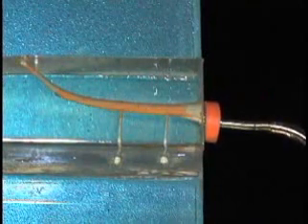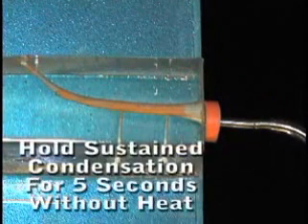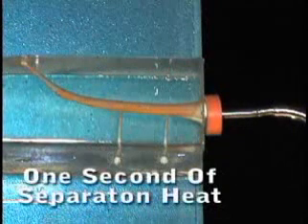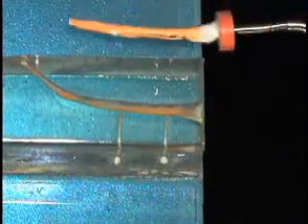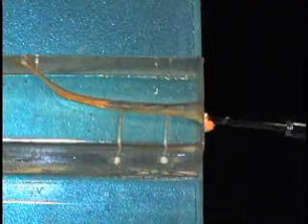In a second and a half or two seconds we'll be within two millimeters of the binding point. We hold a sustained condensation force with no heat, then after five seconds — at least one second of separation heat — pull the plugger out. You can see the surplus gutta percha attached to the plugger. Now we take the narrow nickel-titanium end of the hand plugger and condense the equal mass of gutta percha in preparation for the backfill.